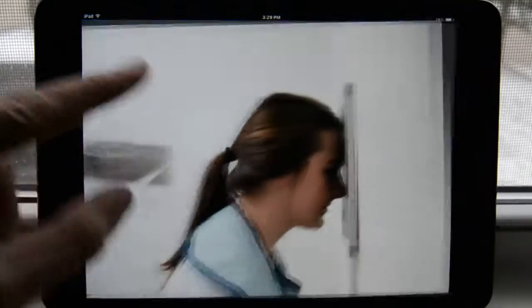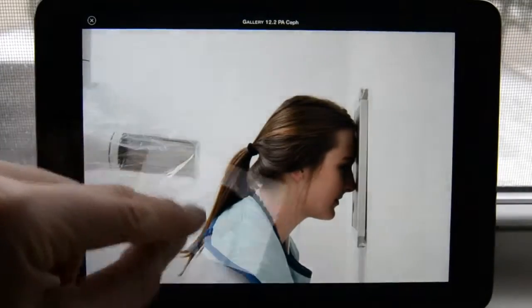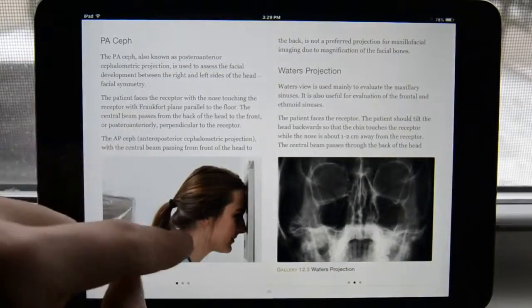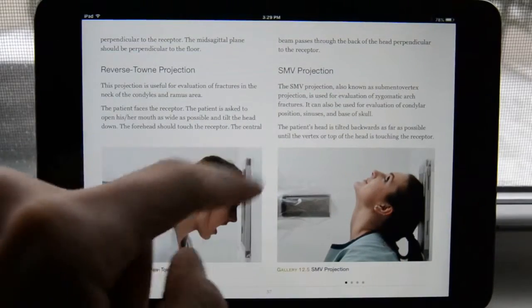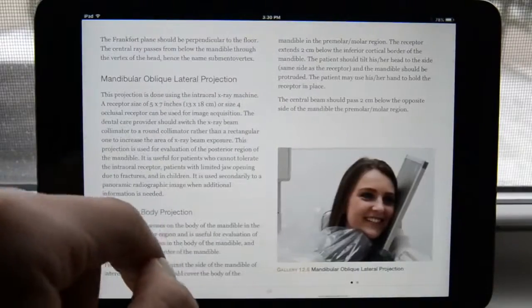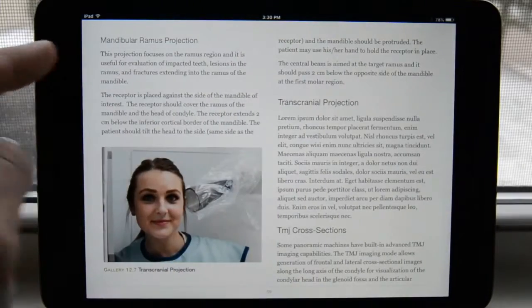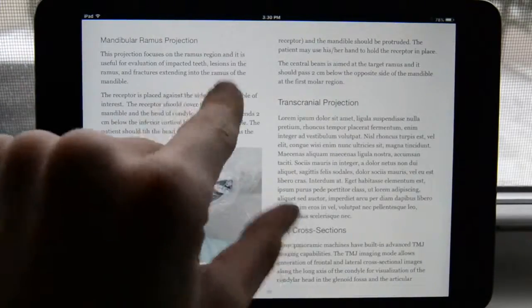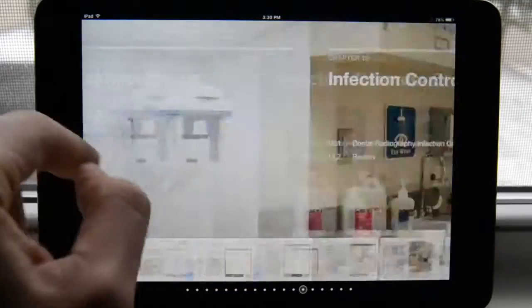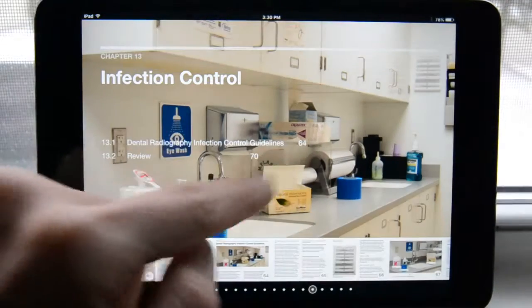Swiping through gives you the corresponding radiograph, and you can also bring it to full screen. Moving forward: the reverse submentovertex (SMV) projection, mandibular oblique projection, and all these other projections are included here.